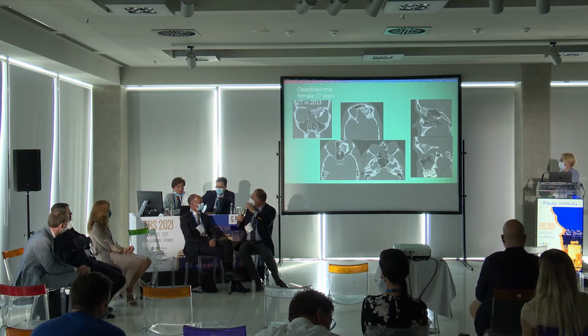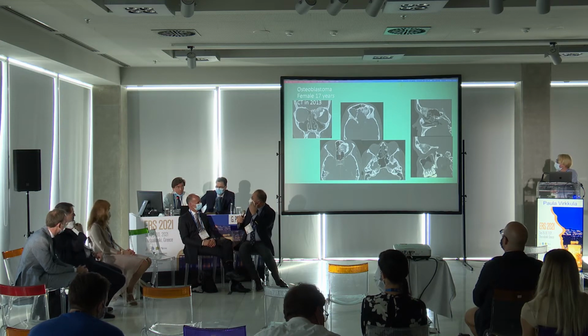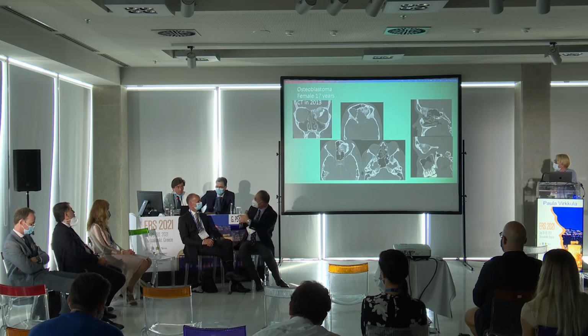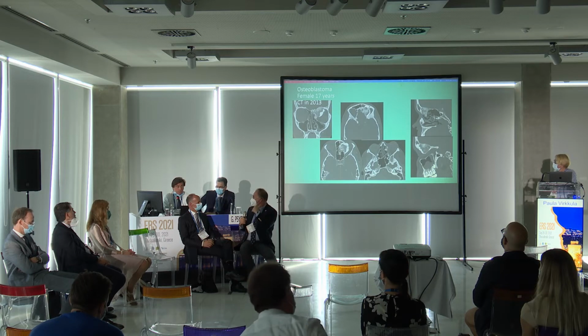But in many cases, I have had the chance to really dissect from the delicate skull base, because there was a little sheet there with mucosa on one side. The second, with the anterior ethmoid artery, what you have asked, that becomes actually in that area the main feeder. So I would really, I mean, now we are only seeing some sections. I would really go through those.